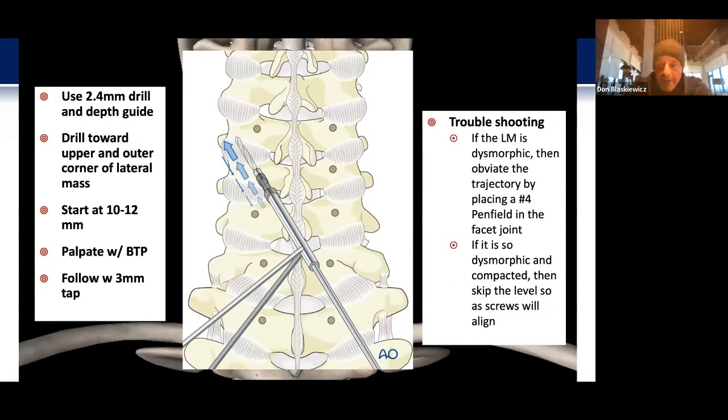For troubleshooting: if the lateral mass is significantly dysmorphic, you can delineate the angle of the facet by taking down the capsule with the bovie and placing a Penfield in it, or just putting the tip of the bovie in it to understand the angle better. Occasionally you'll have very compacted lateral masses that have become dysmorphic over time — in that case I'll skip those levels, or you'll end up with tulips from the screws so clustered together that you're unable to get a rod to seat down.